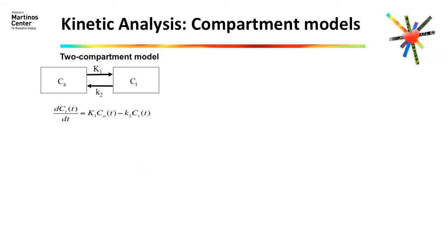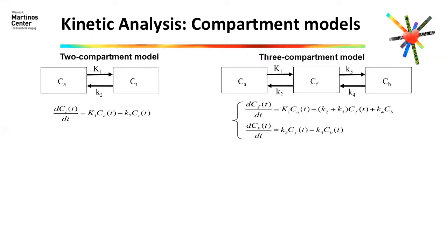That's another why and how, by the way, you can ask. There are great people behind it: Julie Price, Kristin Sander, Hannah Hansen. You can ask them, and I'm sure they will give you an amazing why and how on pharmacokinetic analysis. There's a whole theory behind this. But all I can say is, there are mathematical models that model the biology behind that. Because the tracer, once it gets into the body, is in the arterial compartment, first in the blood pool, and needs to cross, for instance in the brain, the blood-brain barrier. That will be this compartment here.